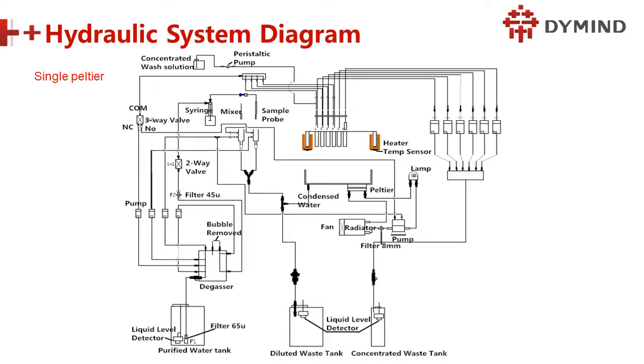So you can see the water goes in from the bottom, and then goes out where? Out to here, to the station. You can see the water is moving up to the wash station and cleaning here, right? It's the same for the well of the mixer. The water is also from the degasser but controlled by another pump, pumping the water past the well and then going up to here.